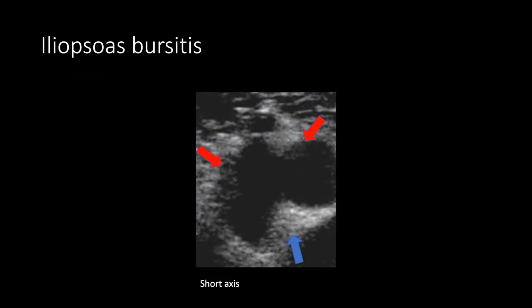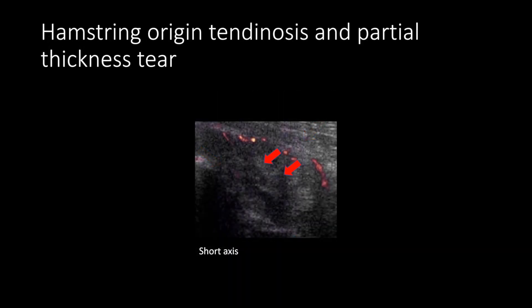This is an example of iliopsoas bursitis. The red arrows show fluid within the iliopsoas bursa while the blue arrow shows the iliopsoas tendon. This is an example of tendinosis and partial thickness tear at the hamstring origin. You can see thickening of the tendon and a discrete anechoic focus shown by the red arrows.